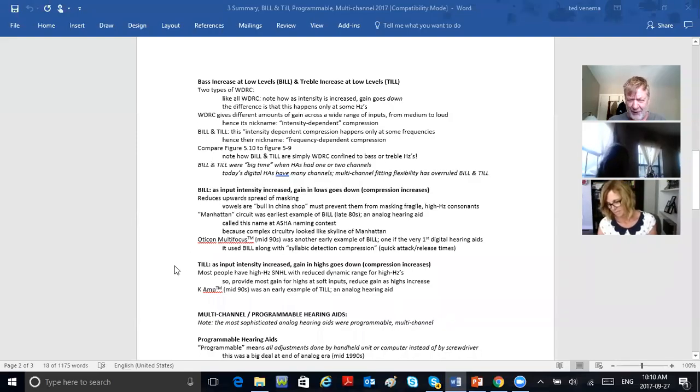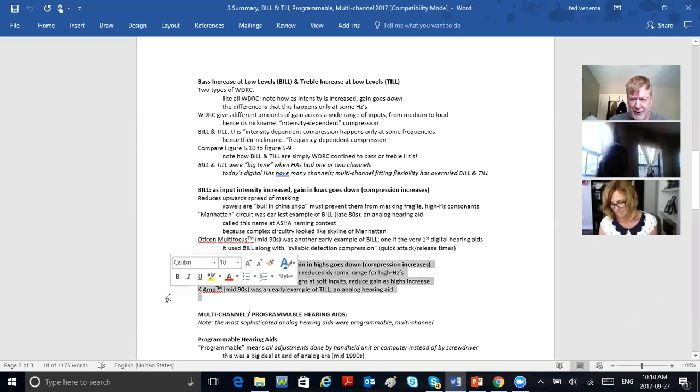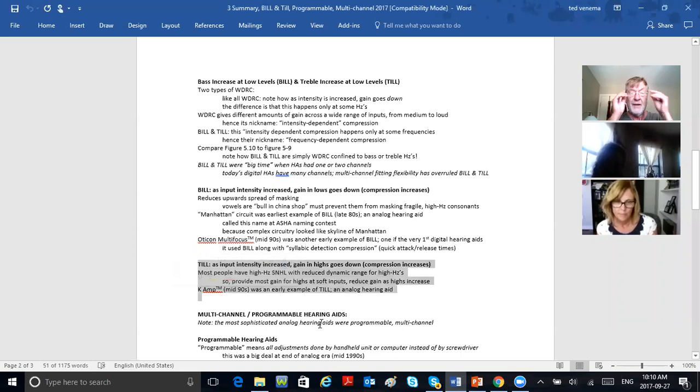So you had the K-amp using Till and the Manhattan circuit using Bill. Two different approaches, two different philosophies. This is a bit of hearing aid history, but what the hey, okay? Anyway, all of that. Now we're at Till. We covered Till as well. Here's your writing on that. There's your writing about K-amp right there.